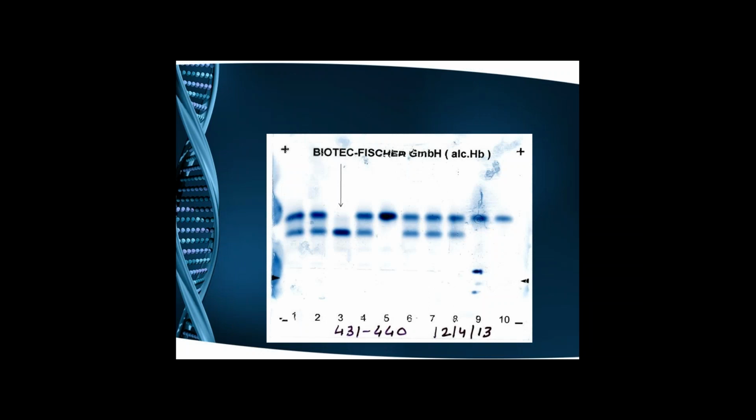And when we repeated it, what we got was this. We did an Hb electrophoresis in which we got the same thick band in the S region, the SDG region. Then we went for a sickling test, which was negative, and with the finding that she is totally asymptomatic, showing a band in the S region, HPLC showing S 85%, but sickling was negative. So we repeated our HPLC with a fresh sample. Next slide.